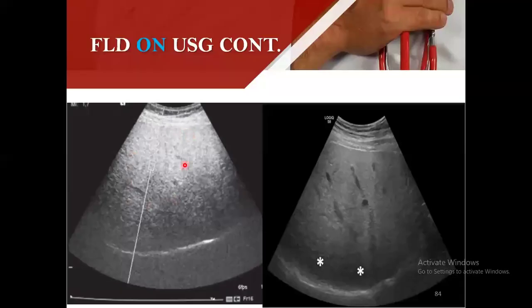So have you seen this? The diaphragm is blurred. You don't even see the diaphragm well. Yes, all this place is white. Check here, attenuation. Do you see the portal veins and the hepatic veins well? No. Check here. The portal veins and the hepatic veins are in there, but they are not clear at all. Check the echogenicity of the liver. It is abnormal. This is not a normal liver, highly abnormal, because we have seen normal livers earlier.